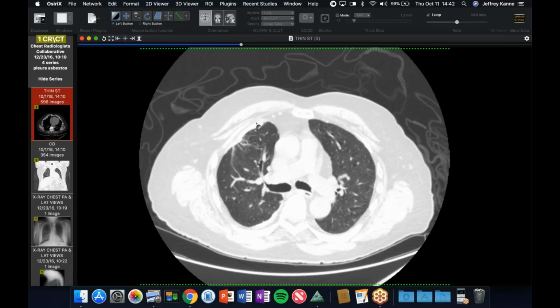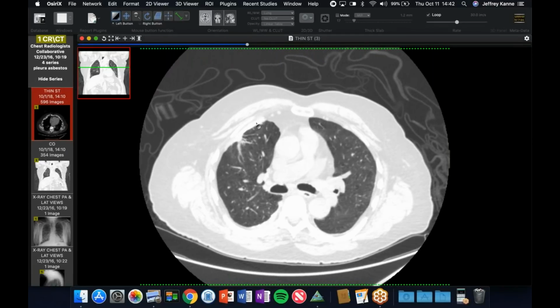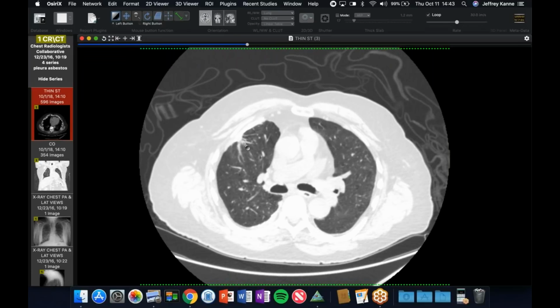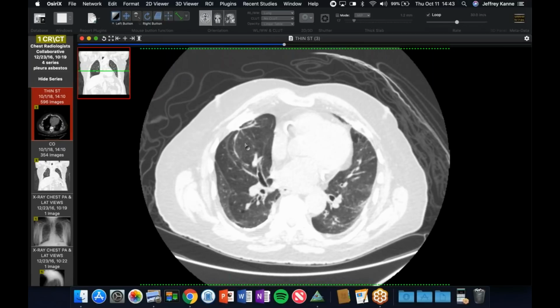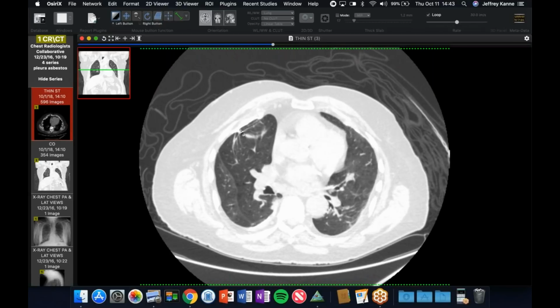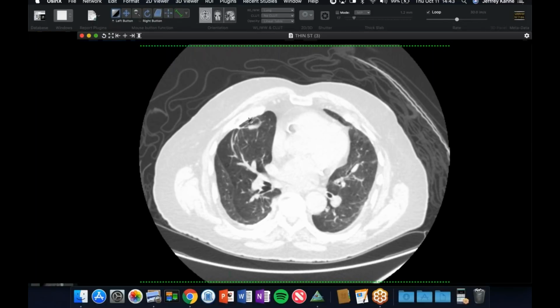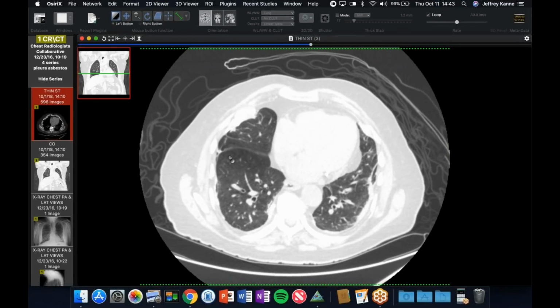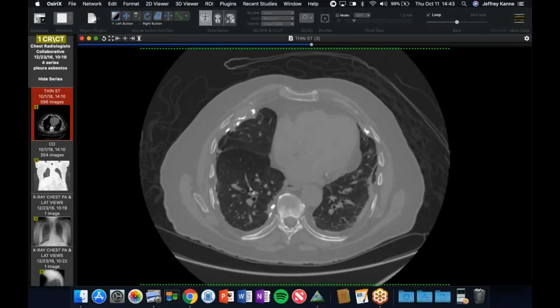But in some cases, and especially when you get pleural thickening, the visceral pleura becomes involved and you get what I like to call tethering of the adjacent lung, sort of like what we see along the spectrum of trapped lung with someone who's had some kind of pleural inflammation or tumor. And because of this, I would not be surprised if this caused some restriction and fixation of the lung. And so because the lung isn't moving freely, as the plaques were growing, they took the path of least resistance and slowly pushed outwards into the extrapleural fat and caused this erosion.